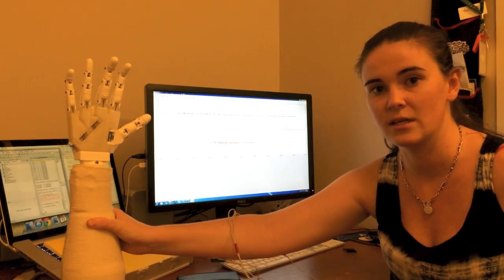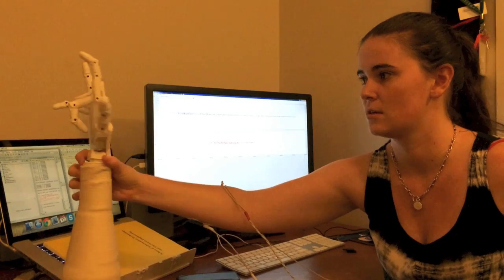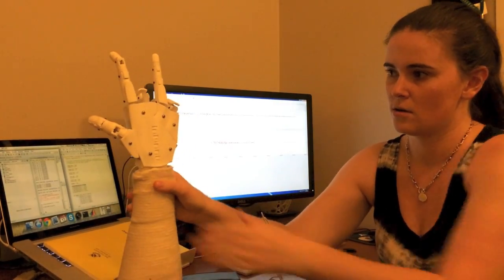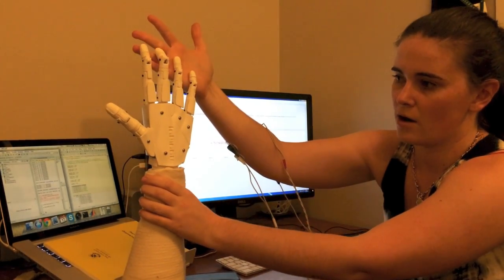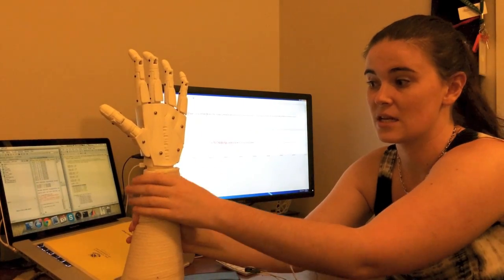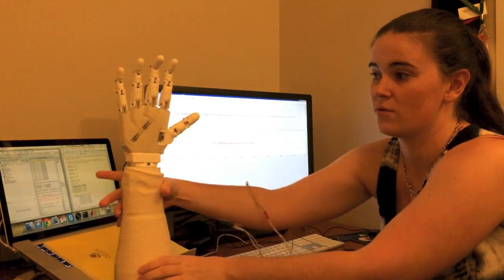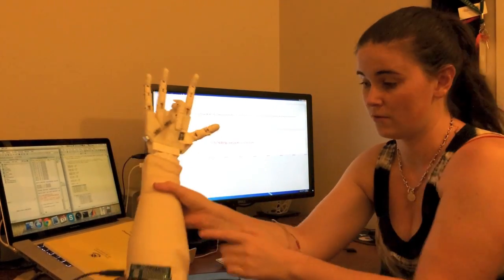It's built completely using a 3D printer. So I've printed all the parts, as you can see here. They're all made of plastic. And then I've wired it up using a ligaments and tendons type design to actuate the fingers with motors inside the forearm here.